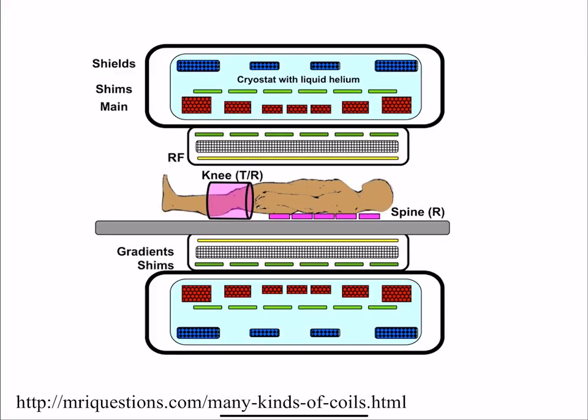But let me just talk a little bit about, if nothing else, I want you to leave this course with a respect for how strong the magnets are. So one thing is, in general, the magnet is never off. Okay? So once we power it up, it's on. And we don't turn it off at night. Because to charge it up is like a $50,000 proposition. So it's not like we're going to be turning it on and turning it off.